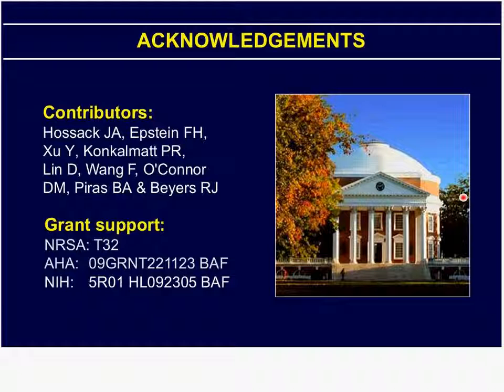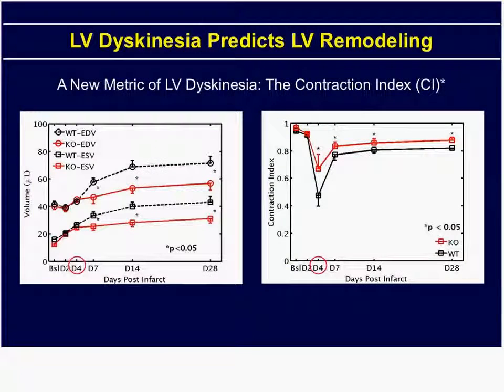Okay. Do you have any suggestions for performing echo on post-MI mice when maneuvering around things like sutures, tissue adhesion, etc.? So that's an excellent question, and our preferred method is to actually change the surgery a little bit, change the access point so that you avoid the region of the chest that you're ultimately going to want to perform echo on.